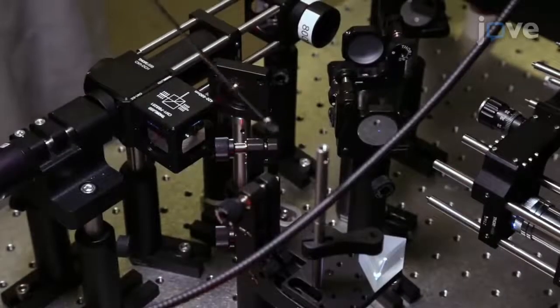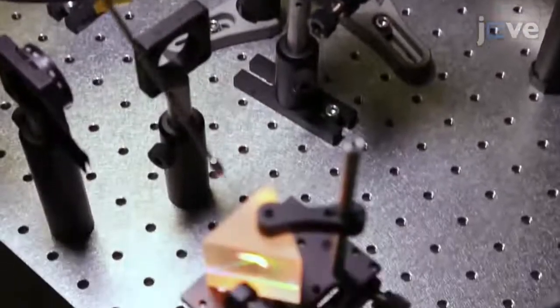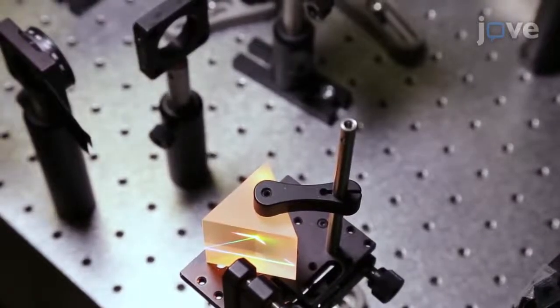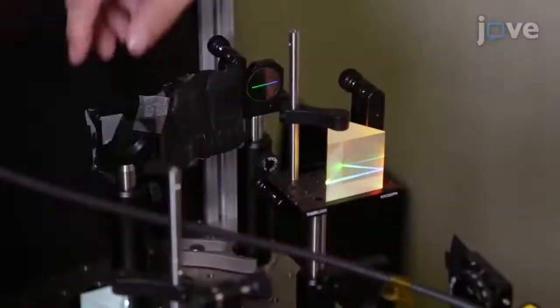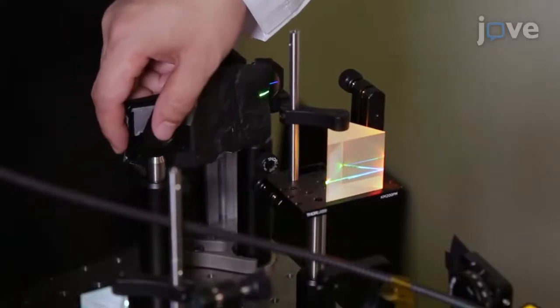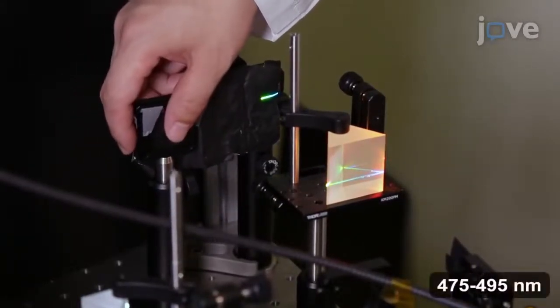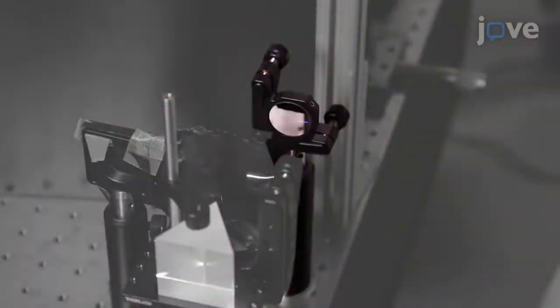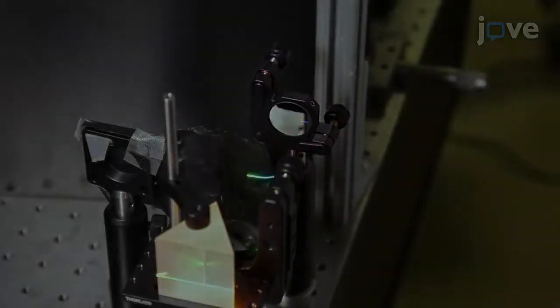The light spectrum is expanded with a pair of dispersive prisms after the beam passes through a polarization beam splitter. A slit is used to select the excitation wavelength range, and a reflective mirror reflects the filtered beam back to the prism pair to couple the light into a single mode fiber.